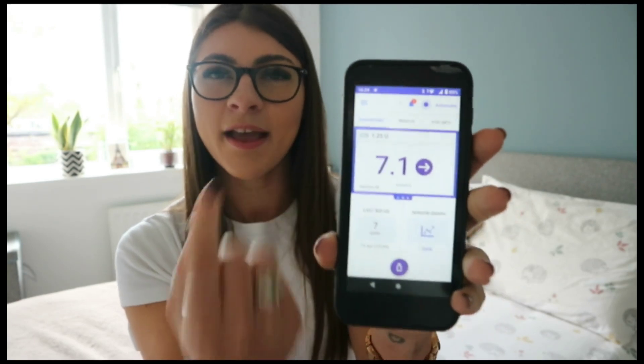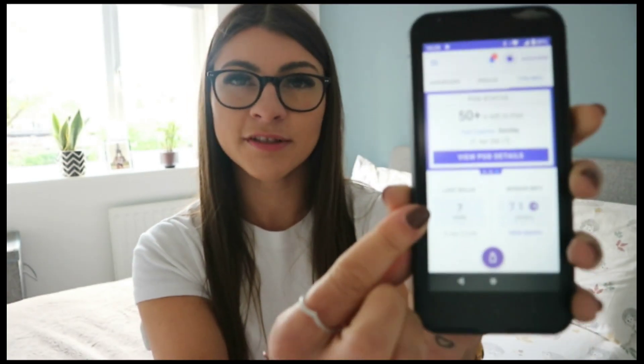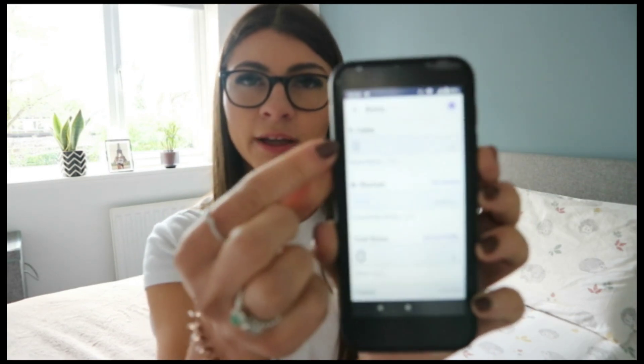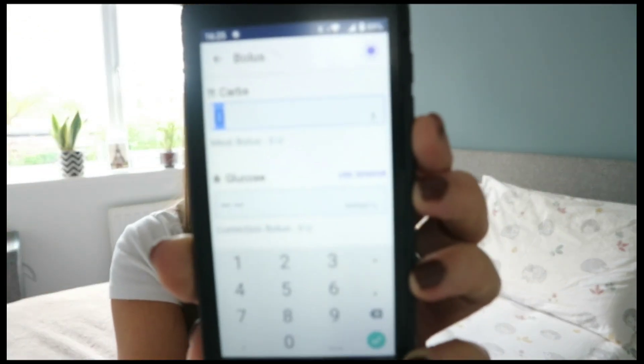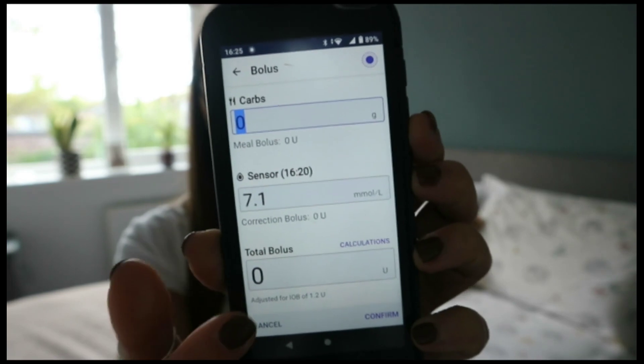This is basically what the home screen looks like: it tells me I'm in automated mode — the system adjusting my insulin. It gives me my blood sugar from my Dexcom, tells me when my next pod is due to be changed — every three days — and shows the last time I gave insulin for a meal or an extra correction dose. The little bottle icon is where I enter how many carbohydrates I'm eating; it pulls up my blood glucose from the sensor, so if I put in 10 grams of carbs for example it would tell me I need 1.2 units.